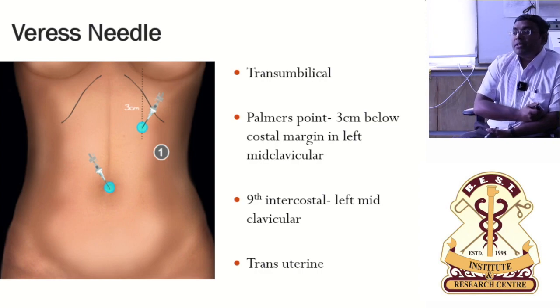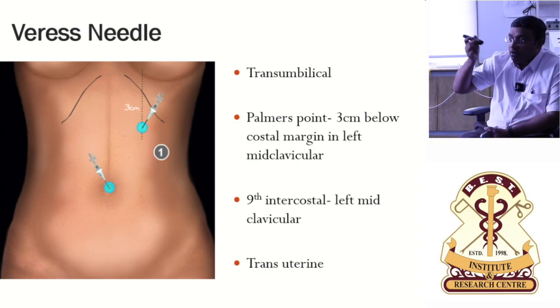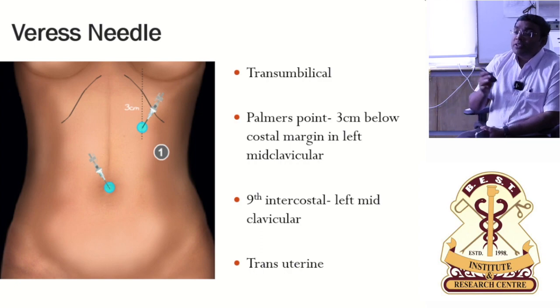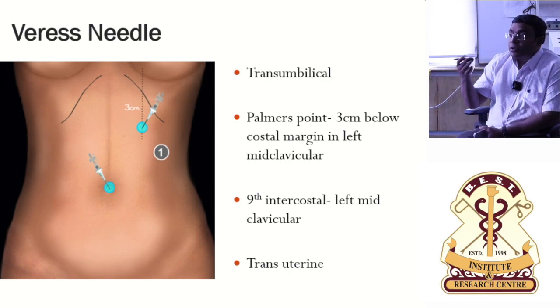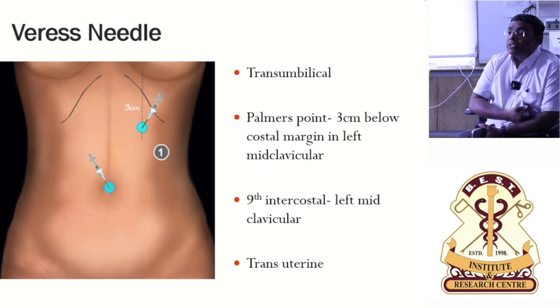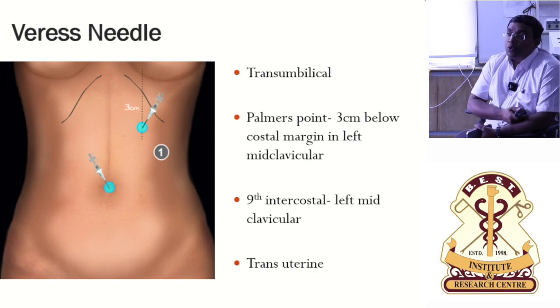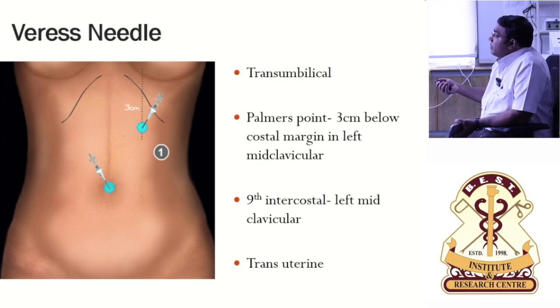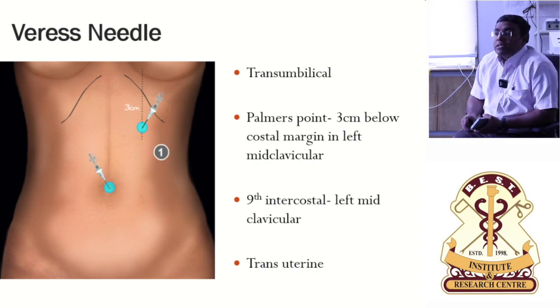Second thing is you palpate the abdomen to know the tone of the abdominal wall. You don't need to apply the same amount of pressure in all the patients. Patients who have had deliveries or whose abdominal wall is lax, in them the amount of pressure required is less. Athletes, thin patients, virgin abdomens, the pressure required is a little more.